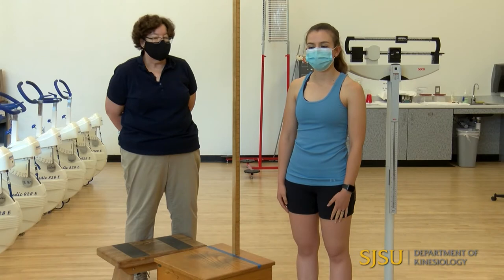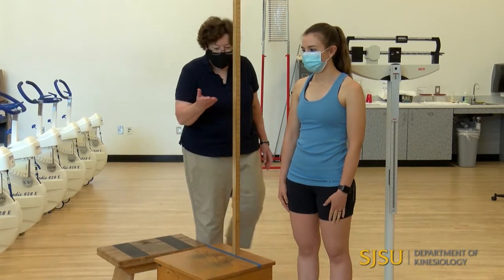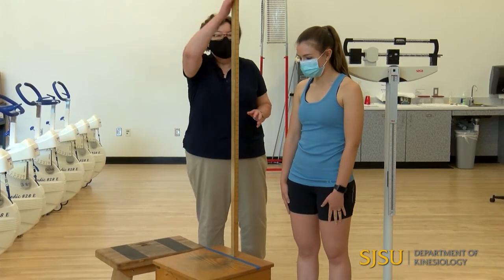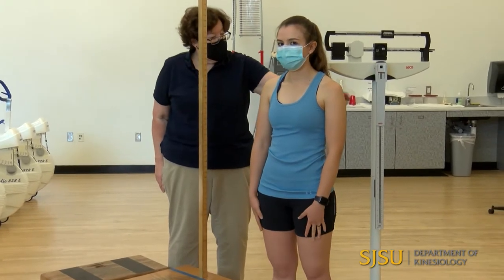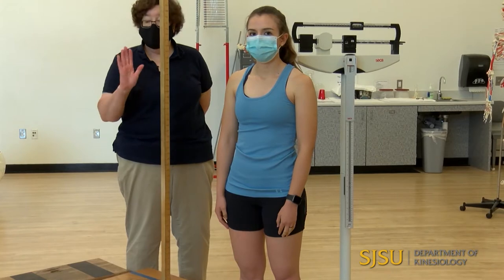We're going to demonstrate how to measure height and weight. You may think that's pretty simple, and it is, but there are some standardized techniques. To measure height, we can either use a stadiometer, which is this device — a platform with a vertical bar — a similar height device on a physician's scale, or you could even measure someone against the wall.